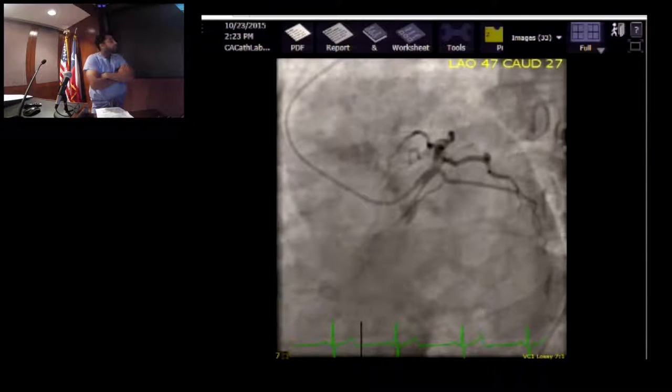I know it'll drift a little bit into angiography and lesion, but first, where is the left main? This is the left main. Okay, which is the LAD? This is the LAD, which is going back. Do you want the pointer? Okay.